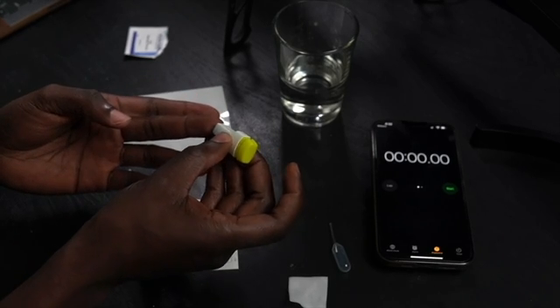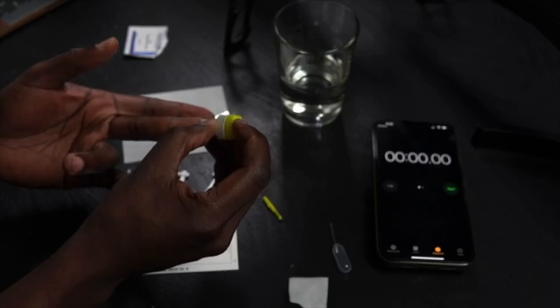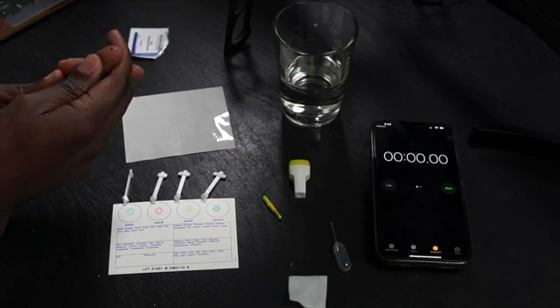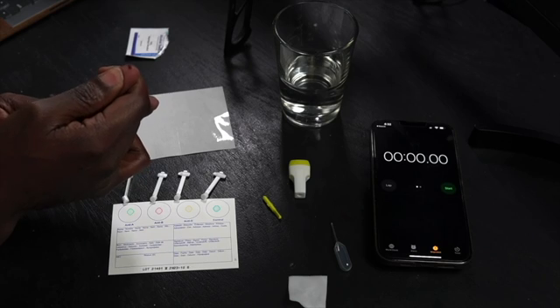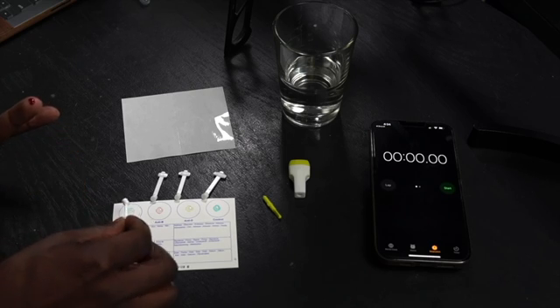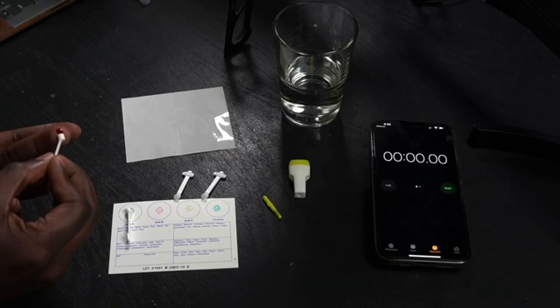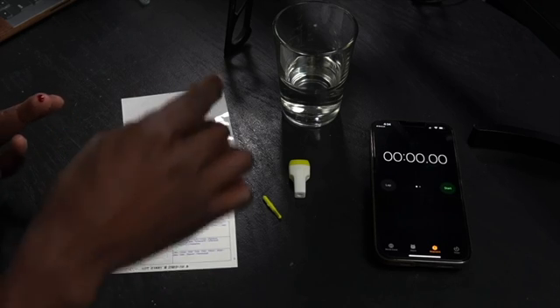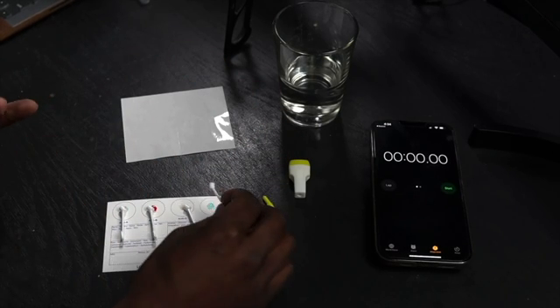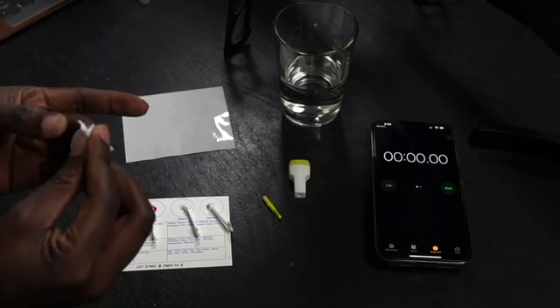So I'm gonna go ahead now and press it towards my finger, and then I'm gonna press this. You ready? Let's do it! There we go. All right, that didn't hurt much. And I'm gonna do that so that I can press my finger, massage it a little bit to get a decent amount of blood. Then I'm gonna take the Eldon sticks and get one little thing of blood and drop that here. I'm gonna get the one for anti-B, get some blood, drop that here. I'm gonna get some blood here, drop that here. And last one, the control group. We've got that there. Then I'm gonna wipe off that extra blood because I don't want to go around bleeding all over the place.